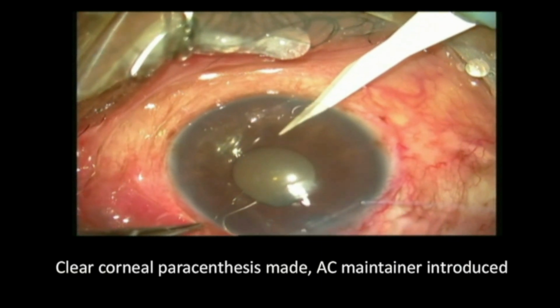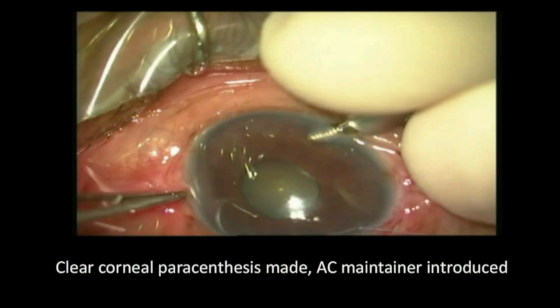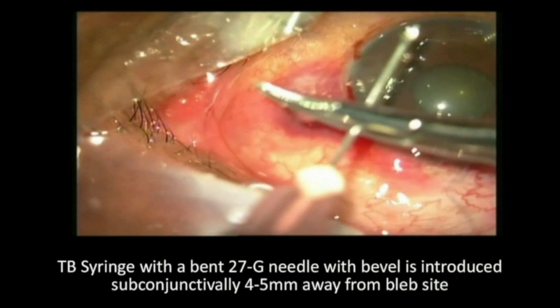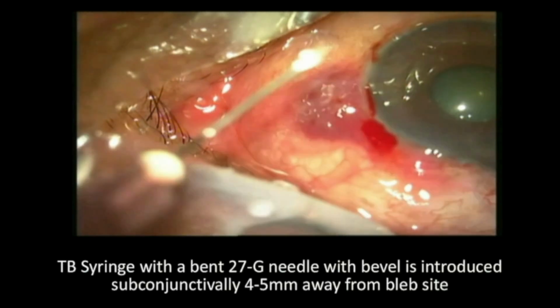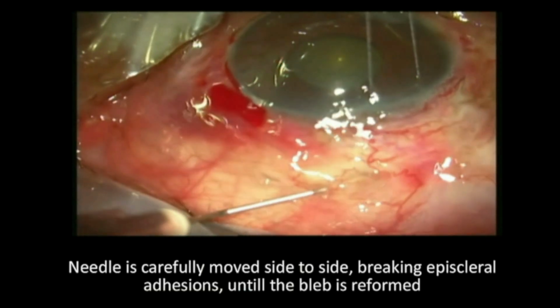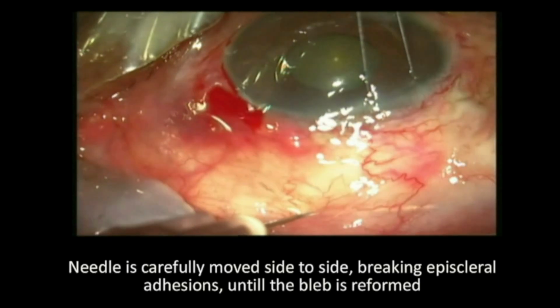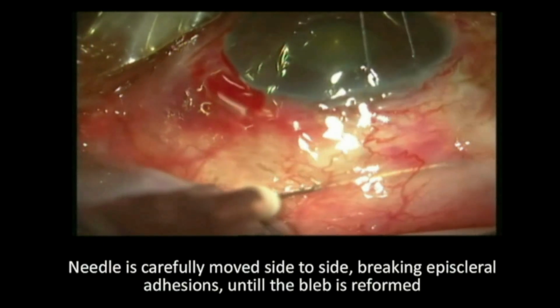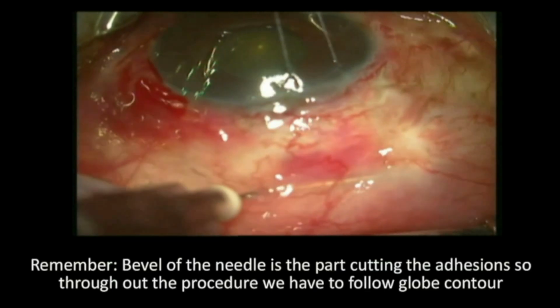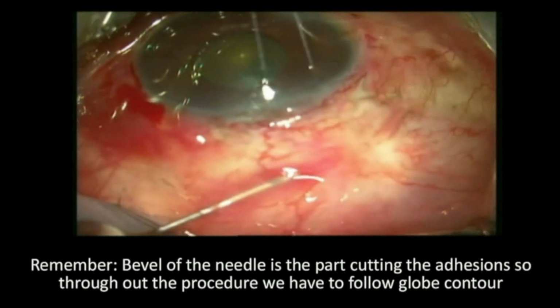A paracentesis entry is made and an AC maintainer is introduced. Here we are using a TB syringe with a bent 27 gauge needle. Remember, the bevel of the needle is the part cutting the adhesion. So, throughout the procedure, we have to follow the globe contour.